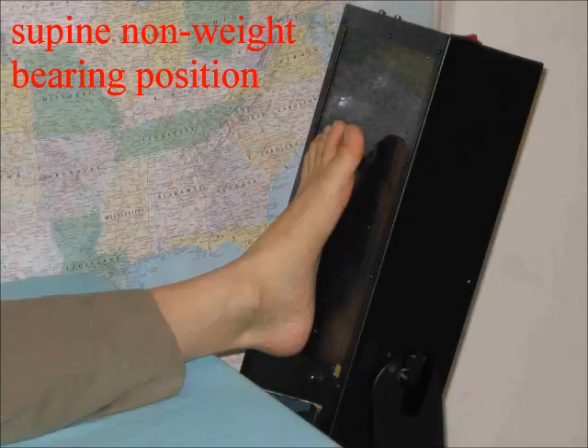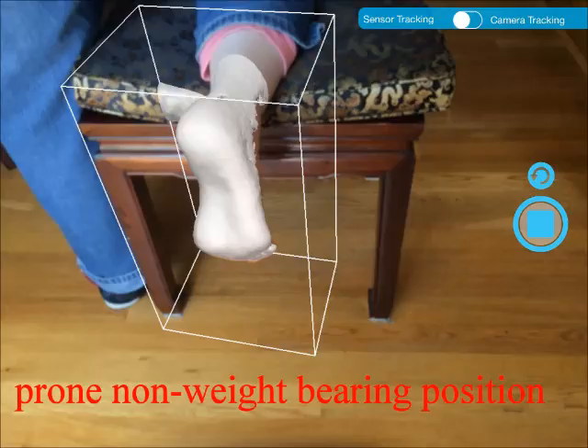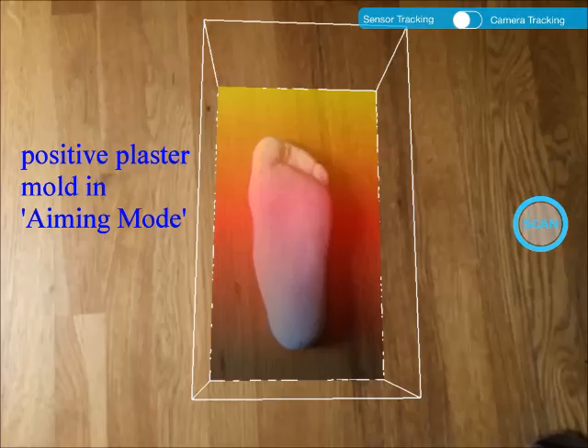With the scanner in hand, you can scan a person's foot with the person in supine, non-weight bearing position, like the position we did with the traditional foot scanner shown here. Or you can scan a person's foot with the person in prone, non-weight bearing position. We found that this position is much easier with the scanner. You do not have to use a bed — you can use just a chair as shown. We can scan a positive plaster cast as shown in this screenshot. The cast is laying on the floor, and it is much easier to scan casts compared to scanning feet.